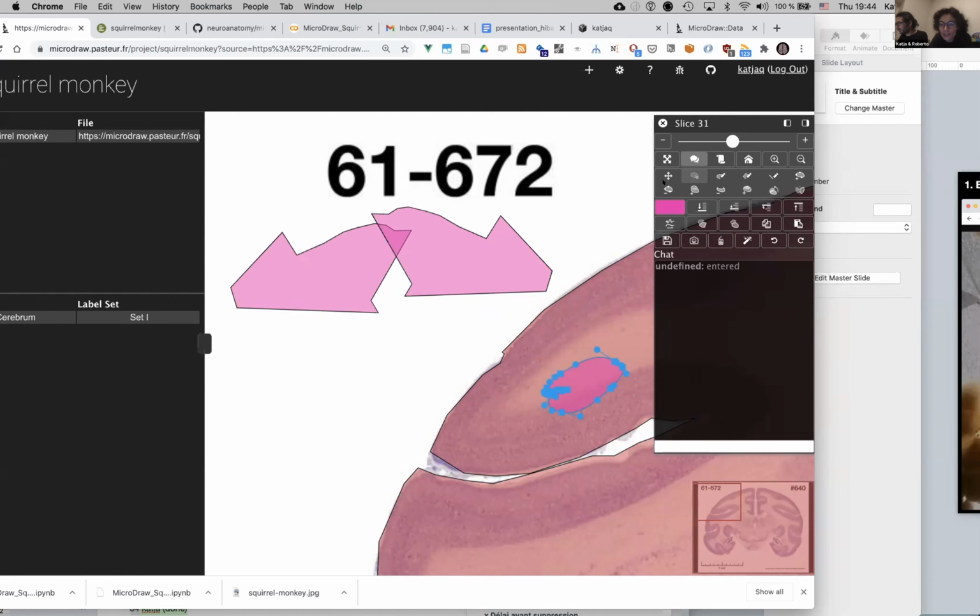And the simplification is also a nice tool. So when you have a region, you can also hit simplify, and again, and it will simplify until the maximum is simplified to recover the shape that you've drawn approximately.